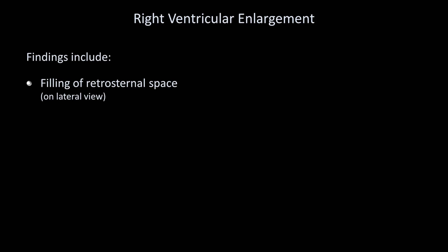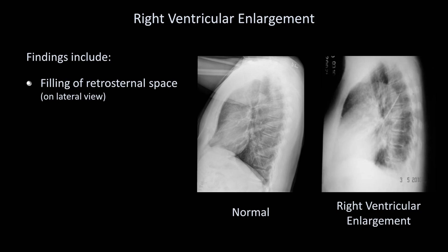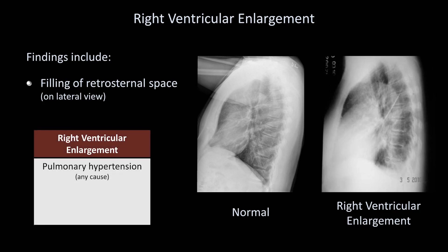The second cardiac chamber whose enlargement can sometimes be individually spotted on x-ray is the right ventricle. The main finding is filling of the retrosternal space as seen on the lateral view. Consider these two lateral films — I have included a normal one for comparison. Examine the retrosternal space directly behind the sternum in the mid-chest region. In the normal film, this will be relatively lucent. However, as the right ventricle is the most anterior of the cardiac chambers, as it enlarges it begins to occupy this space. Etiologies of right ventricular enlargement include any cause of pulmonary hypertension and pulmonary valve disease.